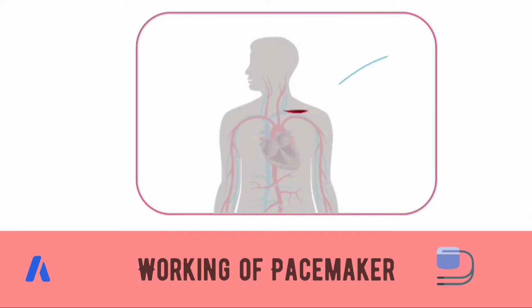A dual or biventricular pacemaker has a stimulating electrode in one chamber and a second sensing electrode in another heart chamber. The pacing electrode stimulates the myocardium through electrical impulses, whereas the sensing electrode detects the heart's own spontaneous electrical activity. When a sensing electrode detects electrical activity in the heart, it inhibits the pacemaker from generating an impulse. The sensing electrode reactivates the pacemaker to emit an output pulse in the absence of appropriately timed electrical activity in the heart.